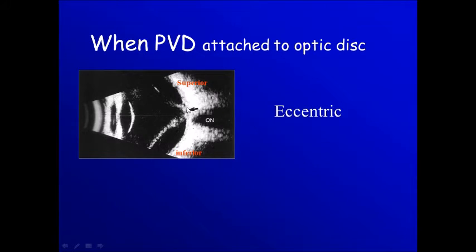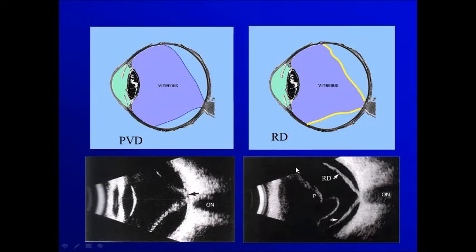We notice that if there is attachment between the posterior vitreous detachment and the optic disc, this attachment is eccentric — it's not in the middle of the disc. This is important to separate between retinal detachment, where the membrane is centered to the disc, and posterior vitreous detachment still attached to the disc, where the membrane is in an eccentric position.